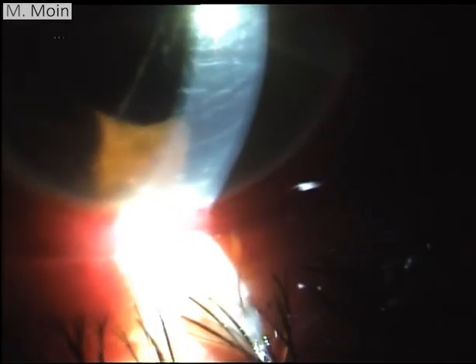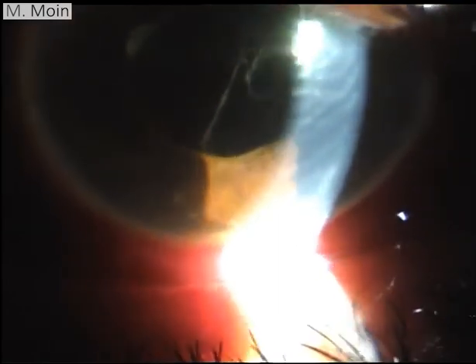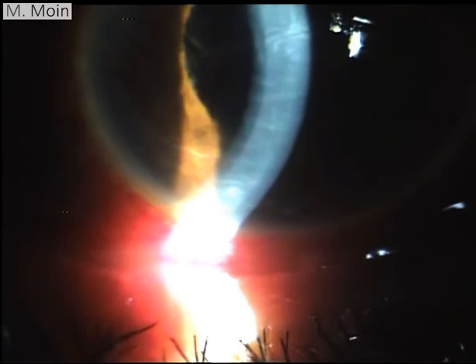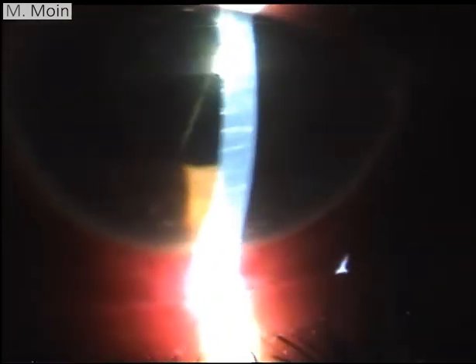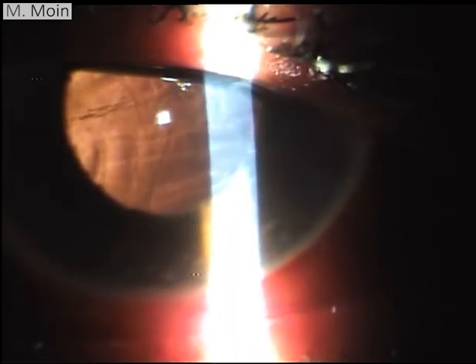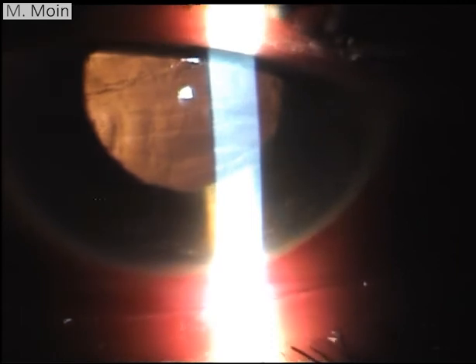And then these vitreous strands are visible, and the conjunctival congestion and the mild degree of chemosis inferiorly are also seen in these patients. The patient developed late onset endophthalmitis, and he had a removal of the intraocular lens using a 5.5 millimeter incision. He was aphakic later on.